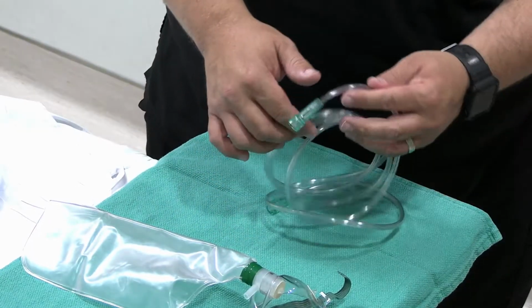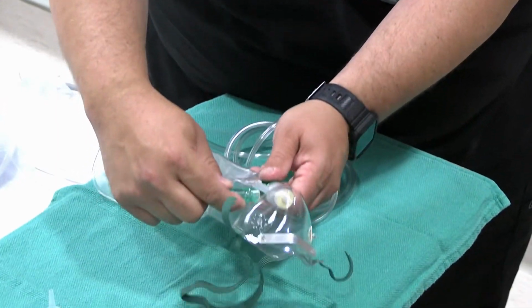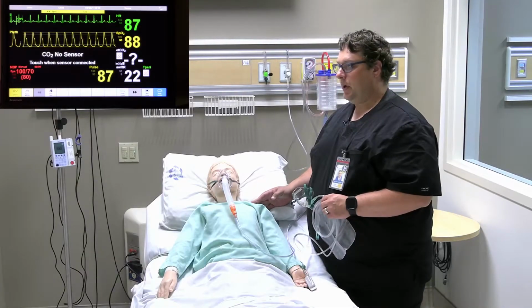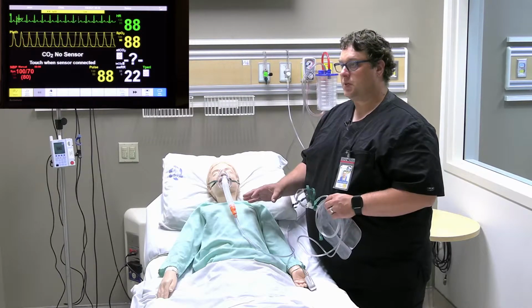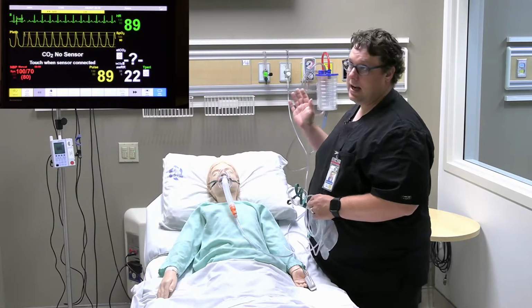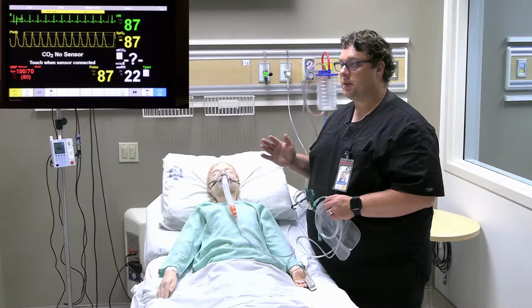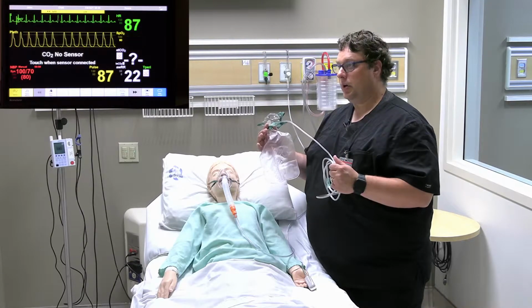Okay, and then you have your oxygen tubing, and that will attach to the side of your non-rebreather mask, just like so. Here we are back with our patient, and we are now up to 50% and 12 liters per minute with the Venti-Mask, and we're still sitting around 88%. So our next course of action is to choose a device that is able to deliver a higher FiO2 percentage. And that essentially is your non-rebreather mask here.